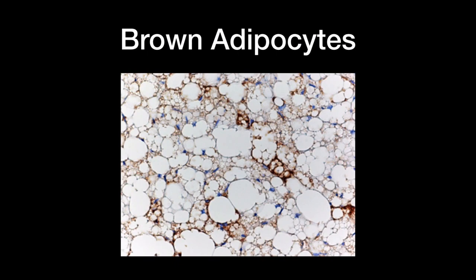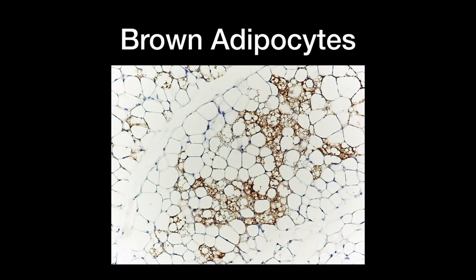The other type of adipocyte is the brown adipocyte. When we are first born, we have a decent amount of brown fat, but as adults we more or less lose it. Brown fat appears brown under the microscope because the cells contain many mitochondria within the cytoplasm. You can see the lipid droplets and that the cytoplasm of the adipocyte is brown. The lipid droplets are also slightly darker than those in white adipocytes.